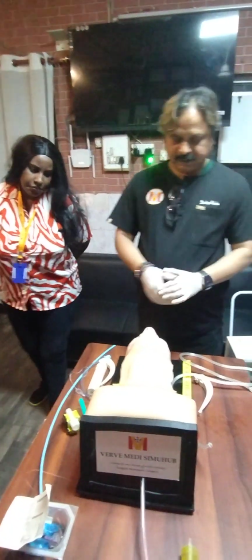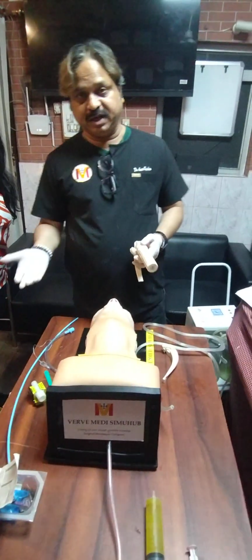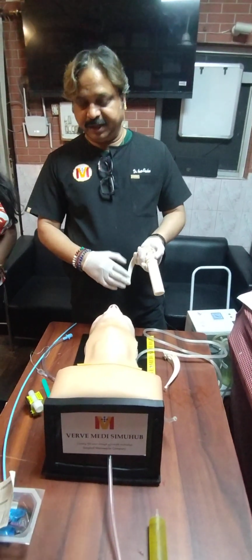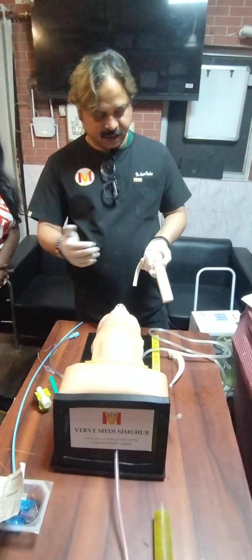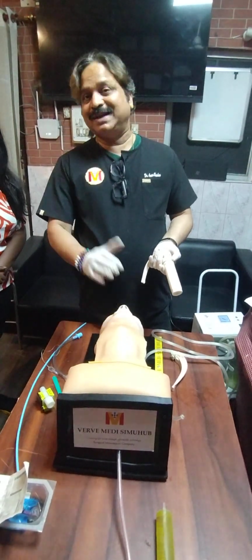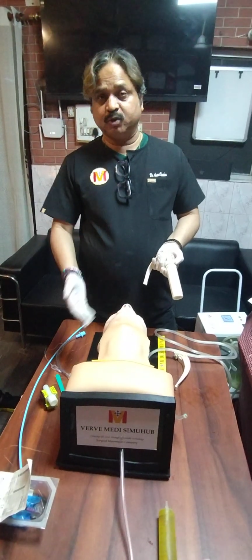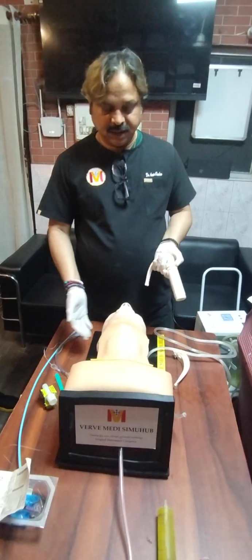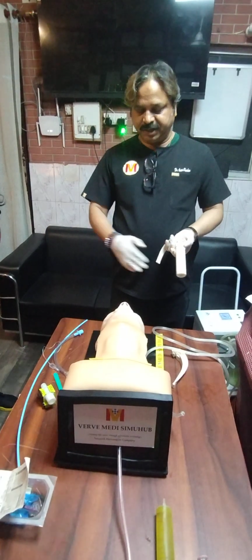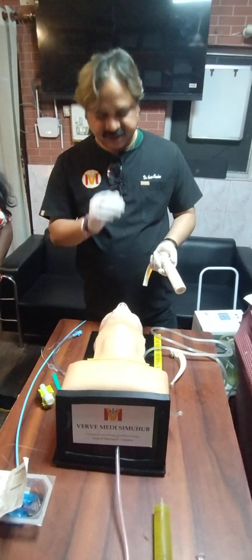Okay. So now coming to the procedure. So this is a patient, we know that we want to intubate, and we have resuscitated him before we are intubating. So it is understood that we have resuscitated. Now we are ready to take the first attempt. When I say resuscitated, it means we have given him oxygen with BiPAP or maybe a CPAP mask, adequately pre-oxygenated and paralyzed. So I'm taking the first attempt.